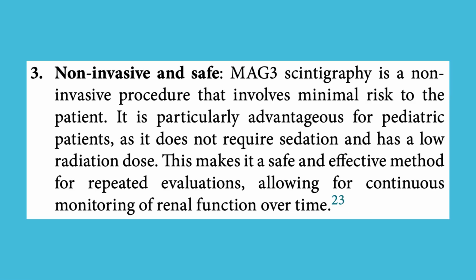3. Non-invasive and safe. MAG3 scintigraphy is a non-invasive procedure that involves minimal risk to the patient. It is particularly advantageous for pediatric patients, as it does not require sedation and has a low radiation dose. This makes it a safe and effective method for repeated evaluations, allowing for continuous monitoring of renal function over time.